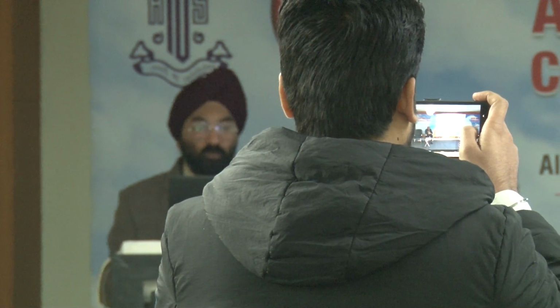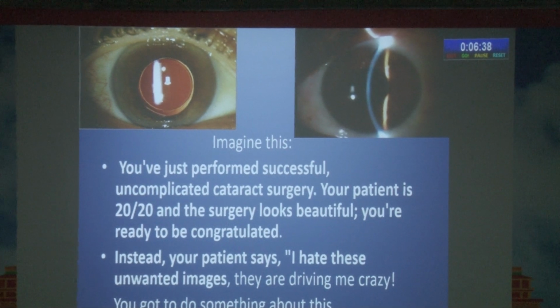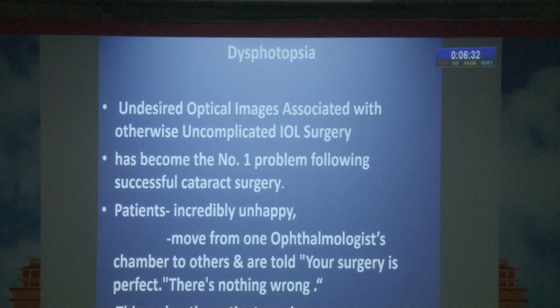The topic I am going to cover is unwanted images after cataract surgery. You have done a perfect surgery and you are ready to be congratulated, but instead your patient starts screaming, "Doc, I hate these unwanted images that you have given me." This is not what you wanted to hear. So what is dysphotopsia? Dysphotopsias are undesired optical images associated with otherwise uncomplicated, uneventful cataract surgery.